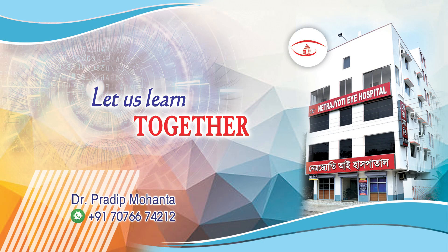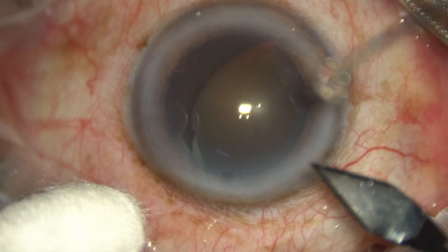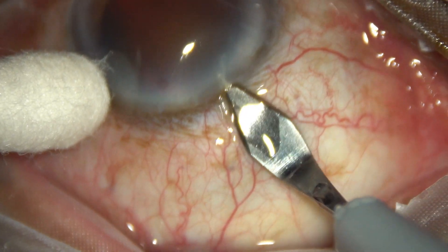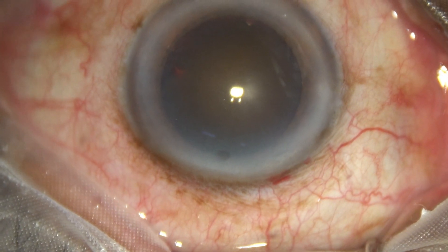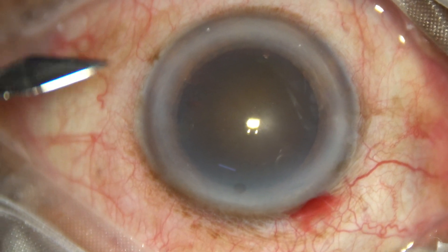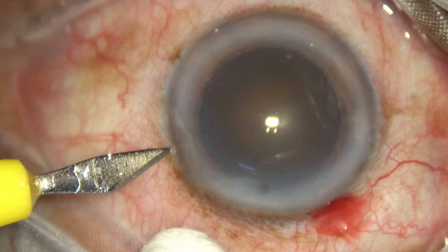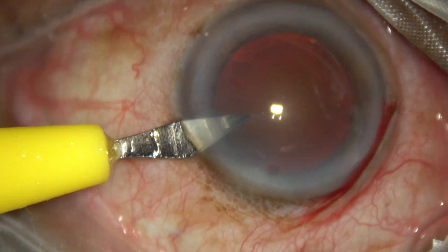In this video we are going to see management of a very hard cataract — a cataracta nigra, a black cataract. This is the main incision with a steel keratome at around 11 o'clock on the posterior aspect of the limbus, and a side port three clock-hours away from the main incision on the left side.